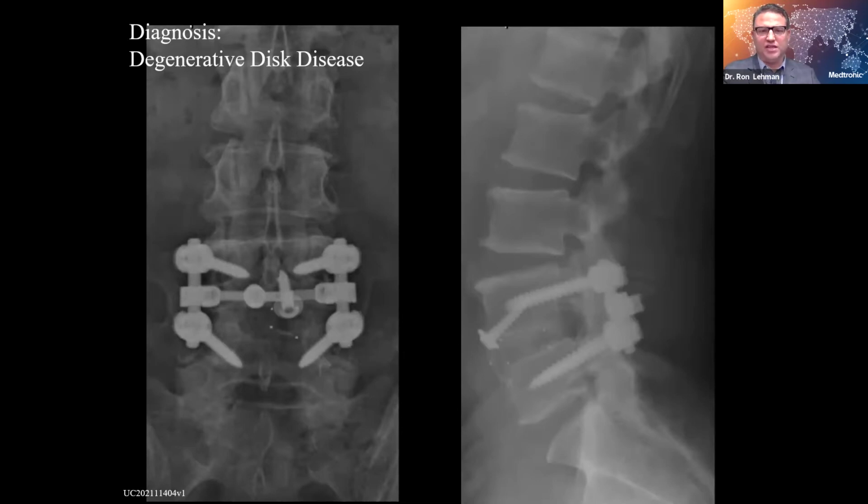But I think there are some other changes here on the X-ray. And Neil, if you want to comment a little bit about what you see here that may be different from what you would have noticed 20 years ago. No, I agree. Like you said, the surgeon did a great job getting a fusion. The instrumentation is great, interbody is great, but I think he didn't pay as much attention to getting the lordosis. And L4-5, as we know, needs a good 15, maybe even 20 degrees of lordosis. I think that's where the issue is, and the effect is seen at L3-4. We've all been prey to this, and we've all done it ourselves. But that reaction at 3-4 speaks for itself with the retrolisthesis there because of the lack of lordosis.